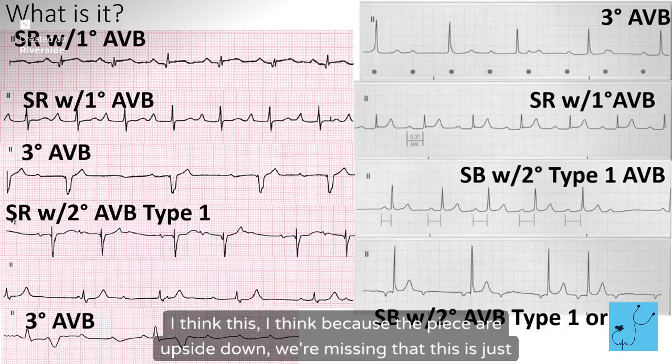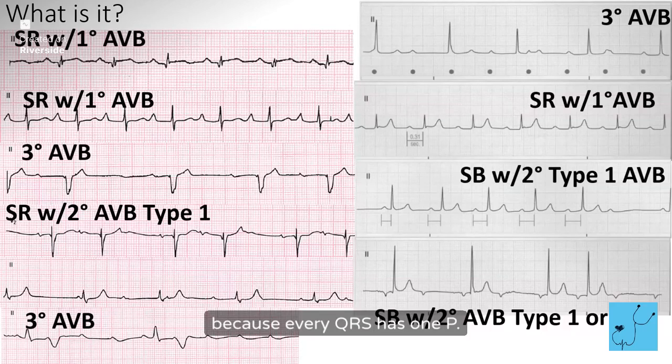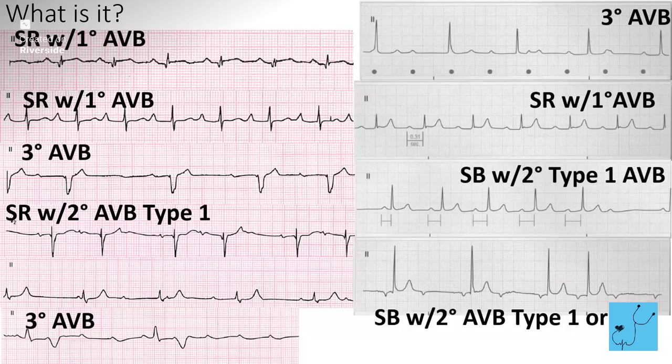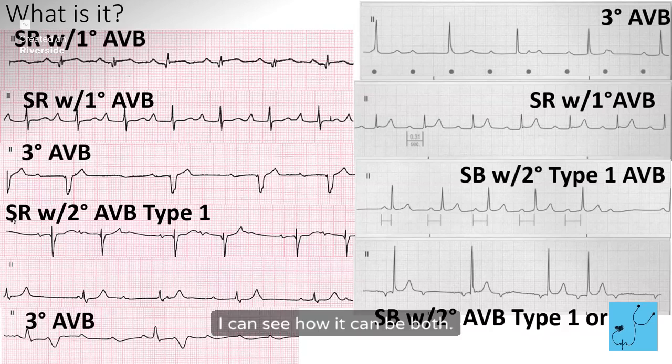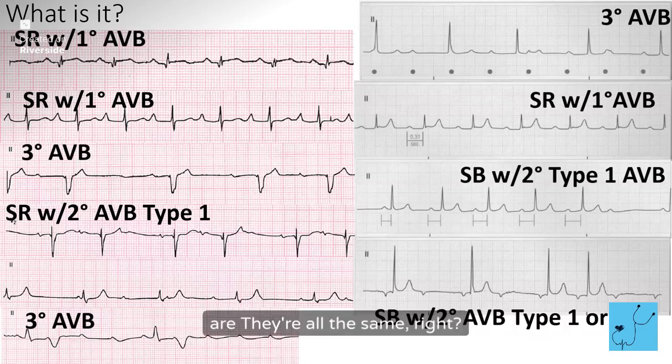I think because the P's are upside down, we're missing that this is just a dropped beat, because every QRS has one P. I can see how it can be both. Yeah, because it's type 1 because you missed the beat, but it's type 2 because all the P's are the same.